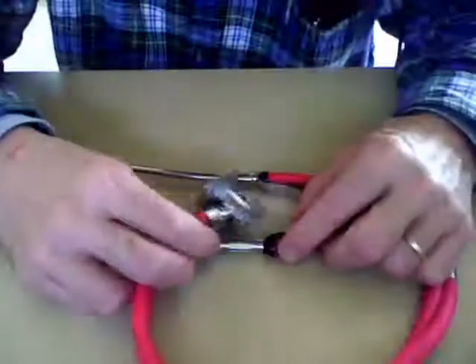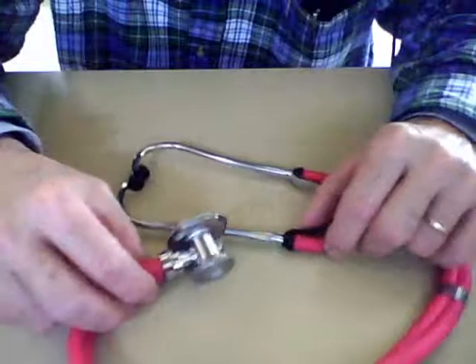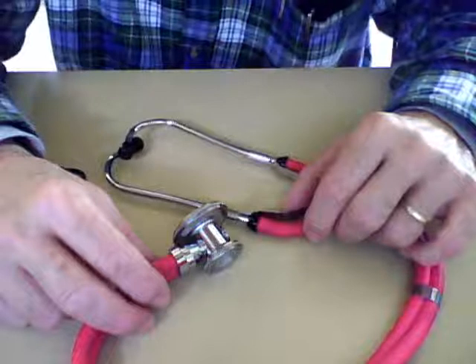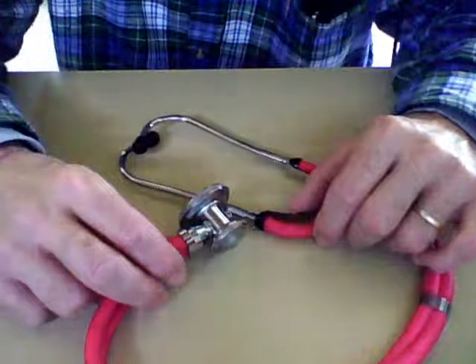Susan just reminded me that this is important to listen for the tachycardia, but I don't have a sensitive enough ear, enough training to know. We do check for arrhythmias with this. Susan does. I personally can't do it, but she does that. It's nice to have it in your kit.